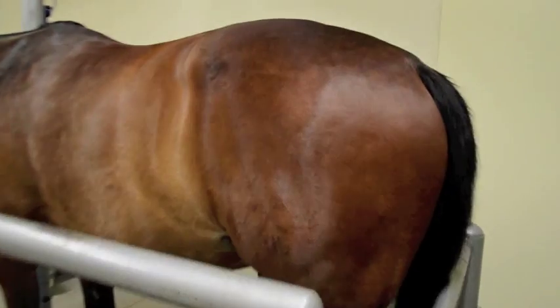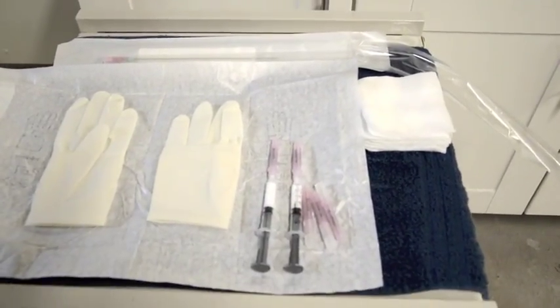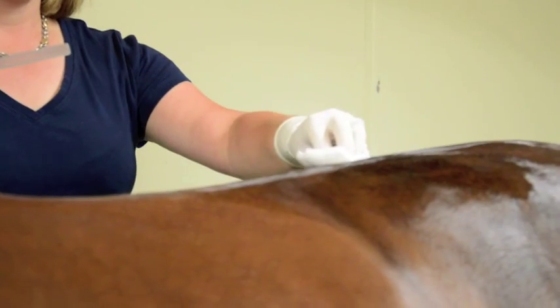The horse is sedated and placed in stocks. A thorough surgical prep of the area is performed prior to treatment with corticosteroids. An 8-inch needle is ultrasound guided to confirm correct placement of the treatment to both the right and left sacroiliac joint.